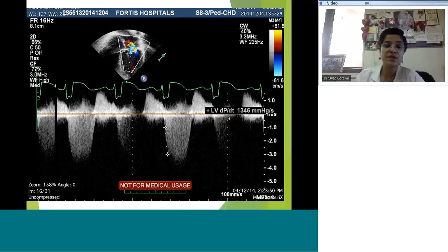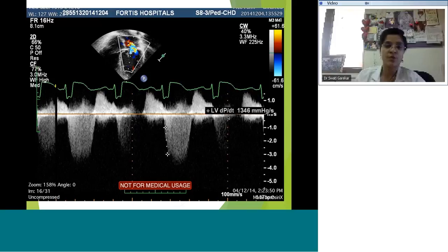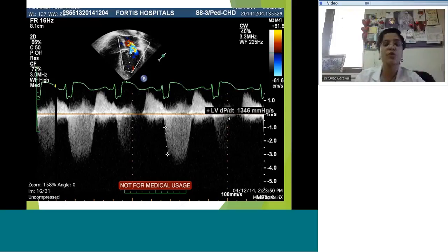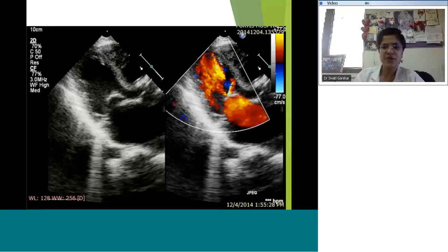When there is significant mitral regurgitation, LV function should be supranormal — dP/dt typically 1600 to 1800 — because the LV has the option of pumping into the low-resistance left atrium rather than against the higher-resistance aorta, so it doesn't have to work as hard and the EF should be very high. In this patient the EF was low-normal and dP/dt is not in the supranormal range we wanted, meaning we have crossed the bridge where it was once supranormal — the function is now deteriorating. This is how you time your intervention.